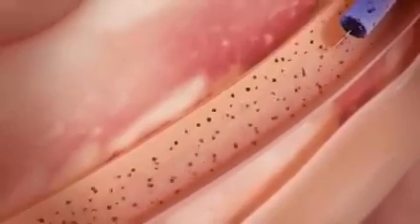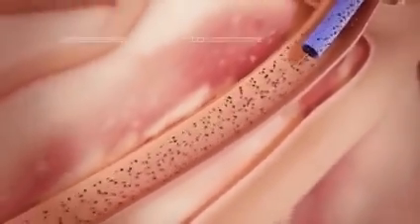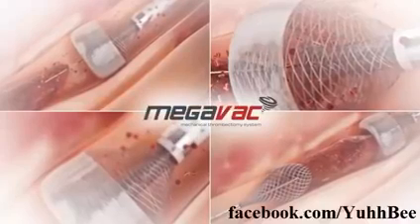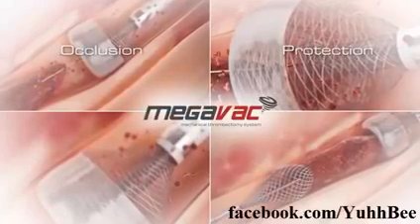Rapid removal of occlusive thrombus with vacuum extraction can accelerate door-to-balloon time and improve outcomes. Four feature solution in one device: occlusion, protection, anchoring, and removal.